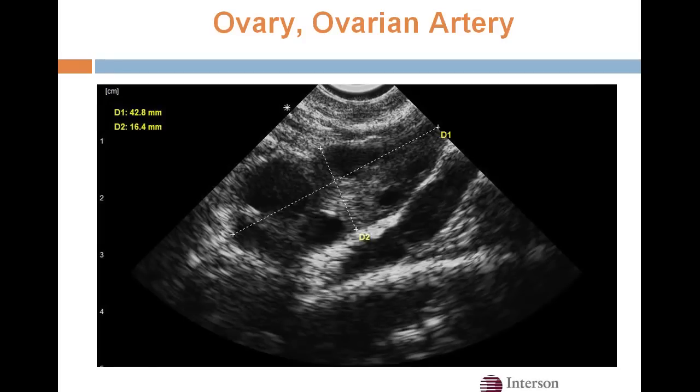Here's an image of the ovary, ovarian artery, and follicles with the transvaginal probe. It's ideal for early pregnancies as well as looking at the adnexa.